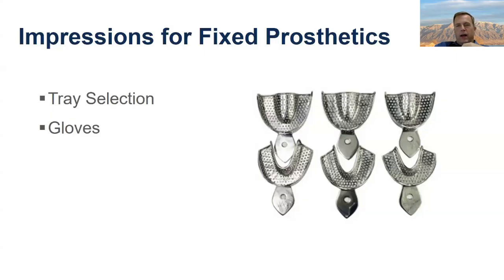Okay, I'll get back on track here. Other thing is, you guys know about this, latex gloves can inhibit the setting of VPS. We'll talk about some of the problems that can happen with VPS, and quite a few of them are related to latex contamination.